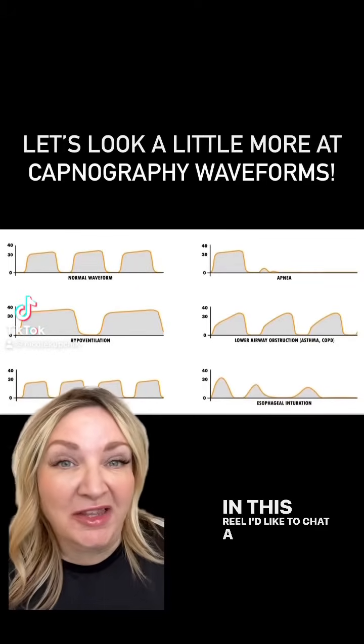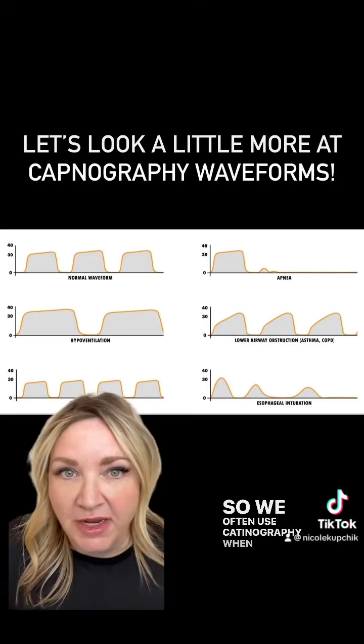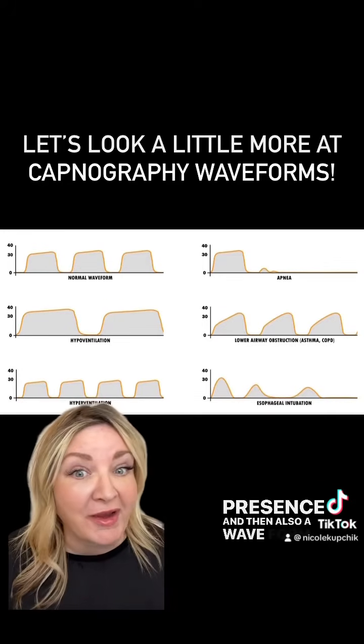In this reel, I'd like to chat a little bit more about capnography waveforms. Okay, so we often use capnography when we intubate a patient, and after intubation, you should see confirmation by CO2 presence and then also a waveform.